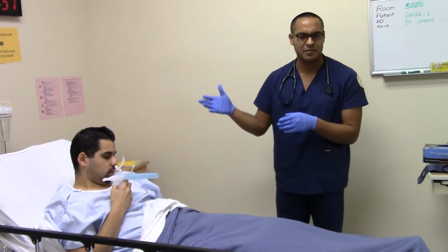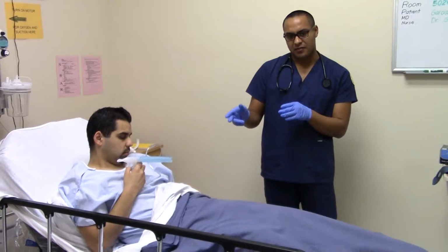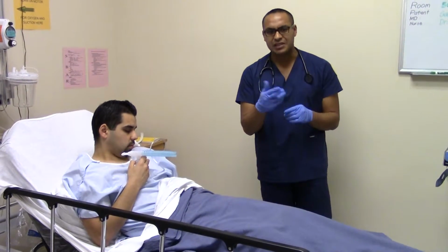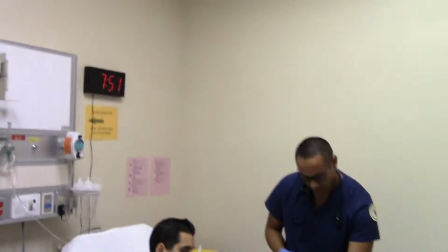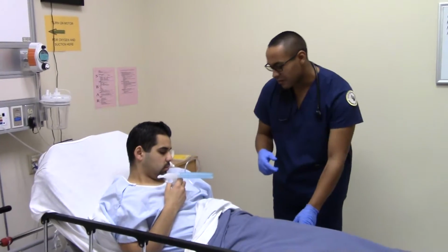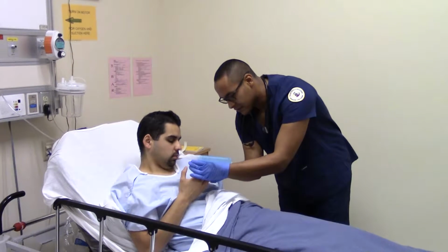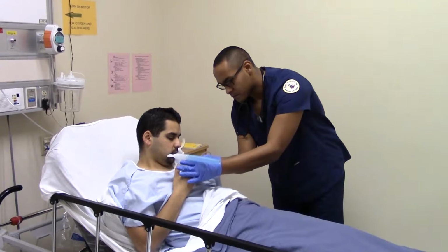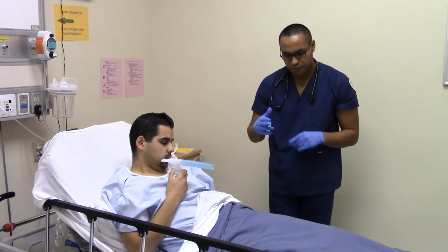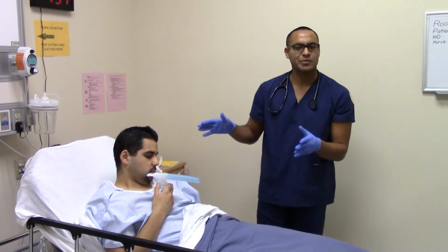So it's been 10, 15 minutes. It's been like 12 minutes, okay? The baffle in the device now tells you it's almost empty. Tap it, if you will. All right, Christian, thank you. All right, Christian. I'm going to tap here. All right. Good. Treatment's over.